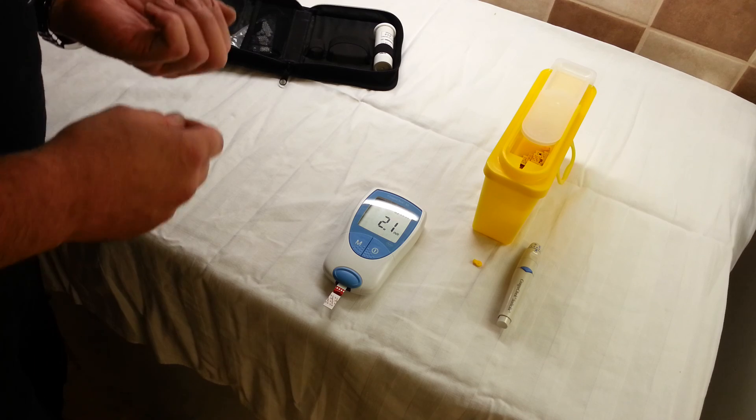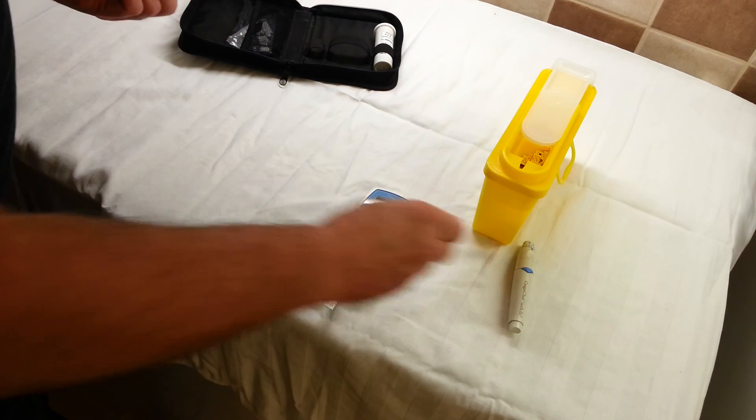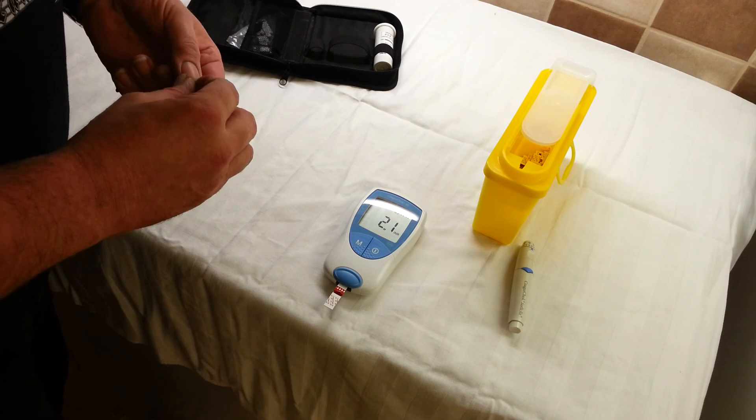We'll discuss dosing, which for me is a bit of a drop, although it's in range. The ruling is that I take the readings, they tell me the doses, and that's all there is to it.